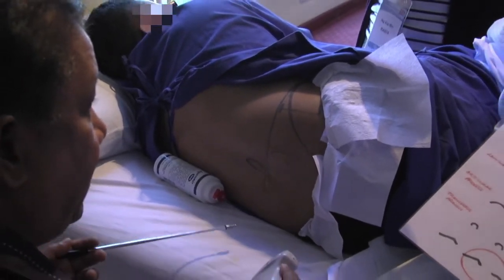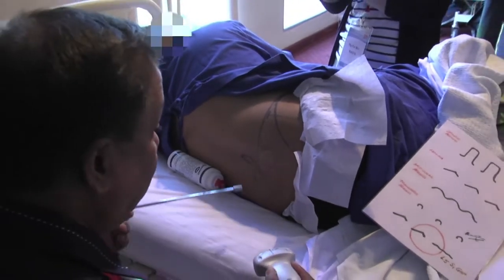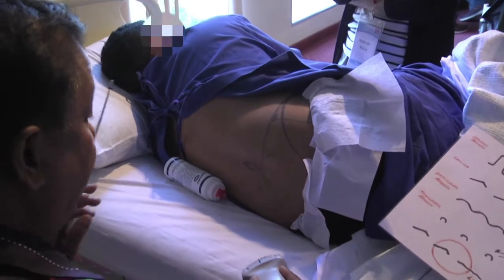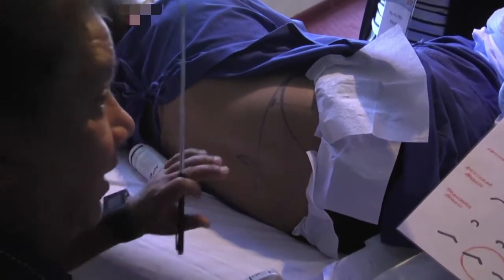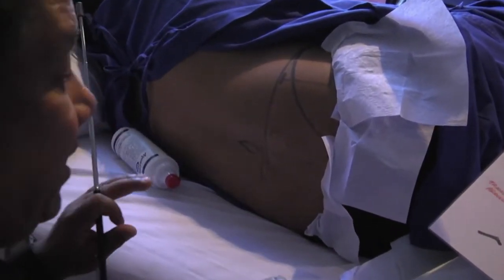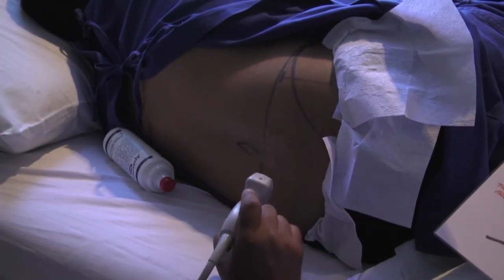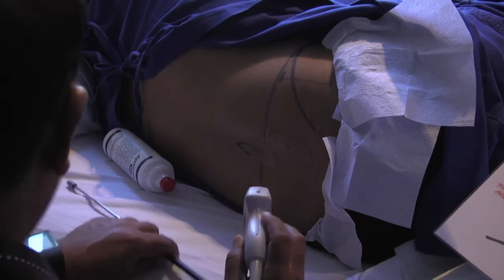And this kind of information can supplement your clinical skills, and you will find that your success rates are much better for the experienced ones. And those who are beginners, they understand the anatomy much better, and their learning curves are much faster, okay? So these are some of the applications. Now let's do the sagittal scan.